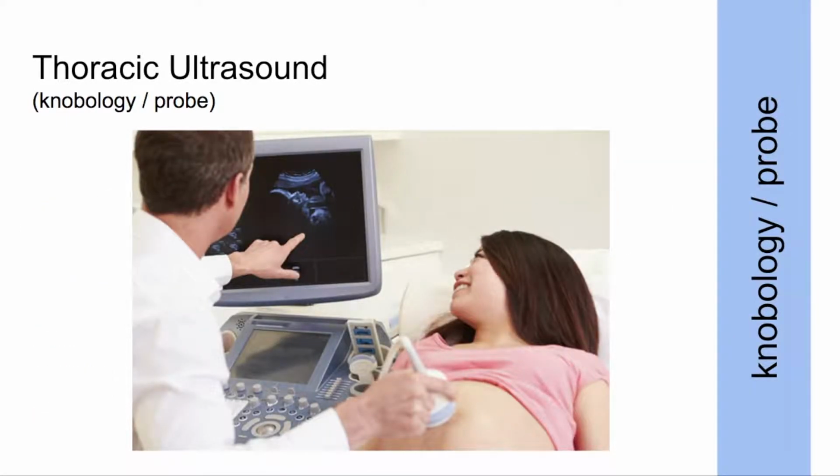The ultrasound machine is positioned so that the screen is easily visible from the operator's work position. Ambient lighting is reduced to maximize screen contrast. Liberal application of gel is the final step prior to scanning. It is advisable to hold the probe like a pen, with the outer part of the hand in contact with the skin. The sonographer should maintain visual contact with the screen while the dominant hand moves the probe across the area of interest, and the other hand is used to optimize the digital image by adjusting the depth and the gain. Findings can be compared with the contralateral side, which can be used as a control.